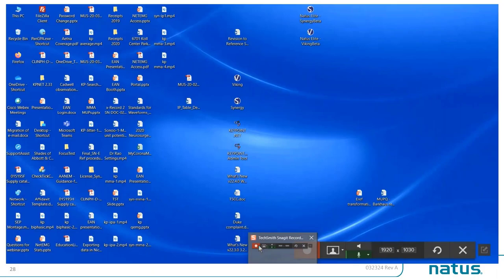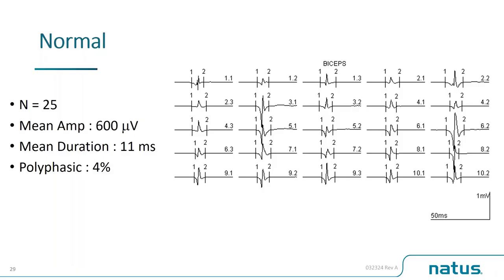This is something that I just wanted to show you in real time. I really want to dispel the myth that quantitative analysis is time consuming. No, it is something that we can use in our routine daily practice. If there is a muscle that is important for diagnostic purposes, I think we should be using these techniques.